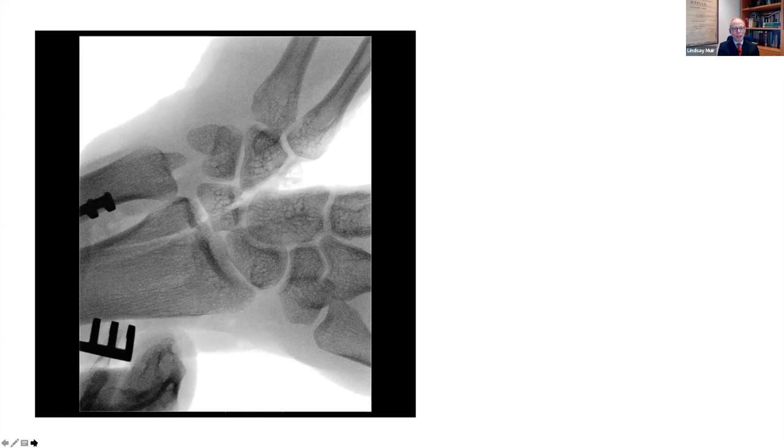So I guess there's some soft tissue reconstruction required in the hand and intermetacarpal ligaments. The radius fracture on the basis of that doesn't look too scary. I need to have a bit of a think about what to do for the lunate. Perhaps wiring across the lunate from either side, from scaphoid into lunate, to compress it and stabilize it, because putting a compression screw across it might seem like a good idea, but is probably not that easy to do.